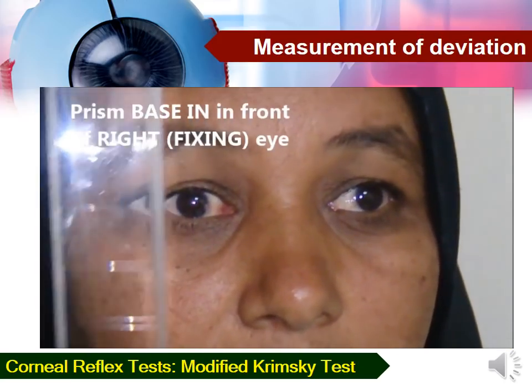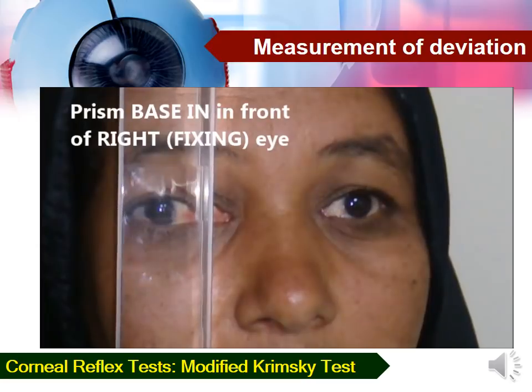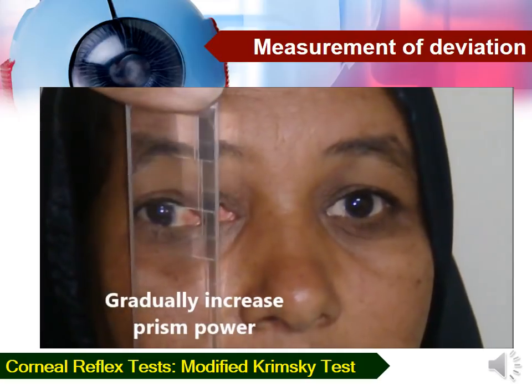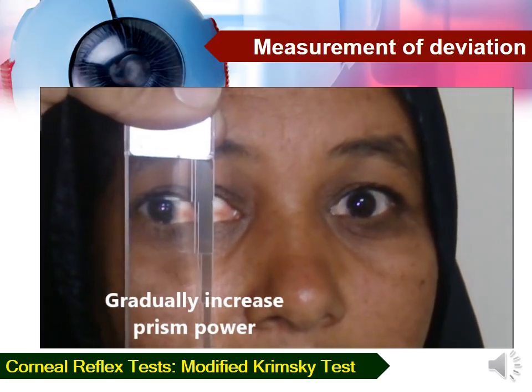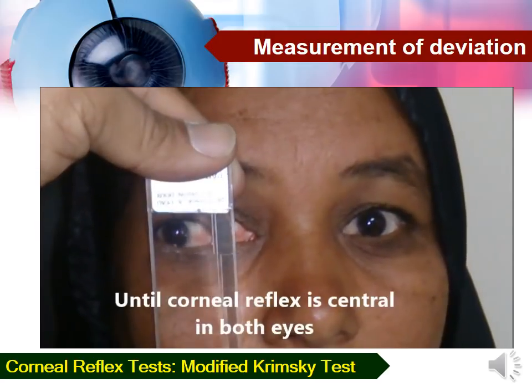This is a patient with a left exotropia. The corneal reflex is on the nasal part of the left iris. We place a prism base-in in front of the right eye, which is the fixing eye. The base-in prism will shift the light to the right side of the patient, or temporally. So the right eye will move to the right, and hence the left eye will also move to the right.